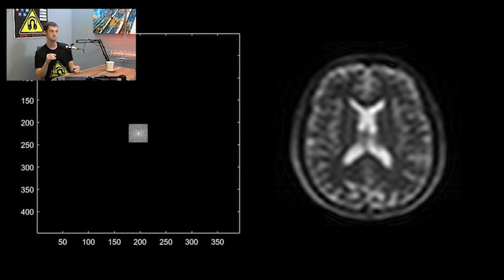And that's important for your work in the sense that if things are going wrong with the center of Kspace, which is like where your effective echo time is, that's the data you're losing, right near the effective echo time.